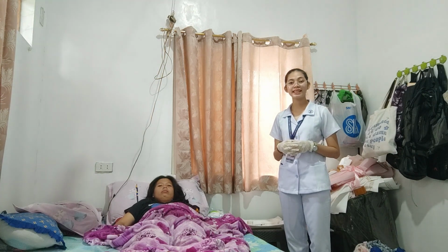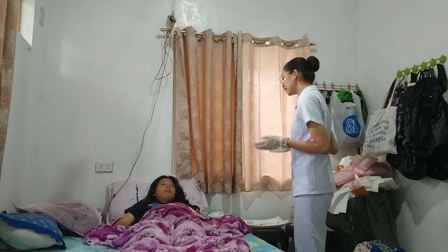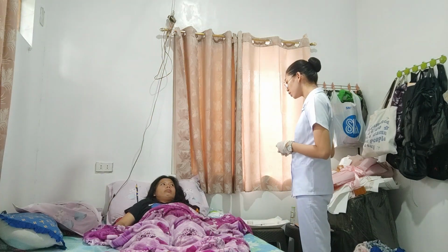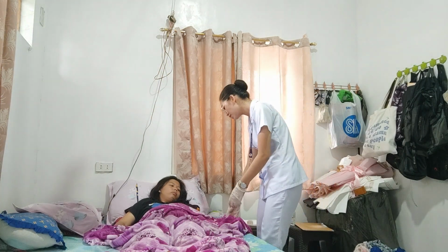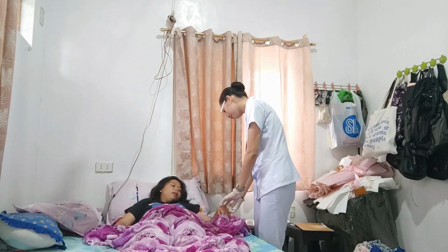After the subcutaneous administration, we are going to proceed to the intramuscular administration. After donning the gloves, we are going to proceed by introducing ourselves to the patient, identify the patient's identity, and explain to the patient what the procedure and medication is all about. Okay. Good day, ma'am. My name is Nika Babes. I will be your student nurse for today. Can I please see your wristband, ma'am? Can you please state your name and your birth date? Ematina Torgo, March 7, 2004.